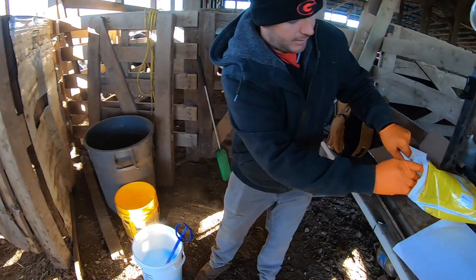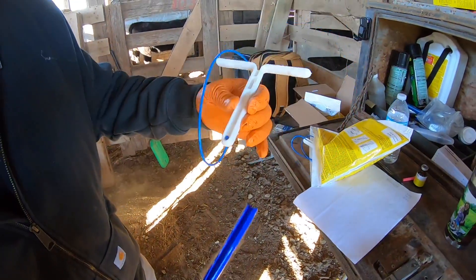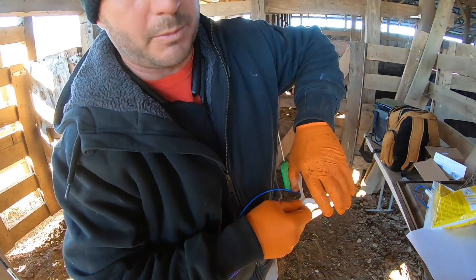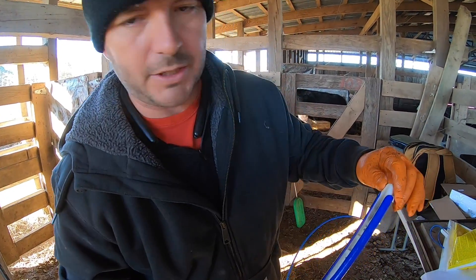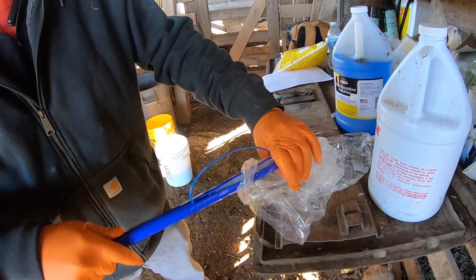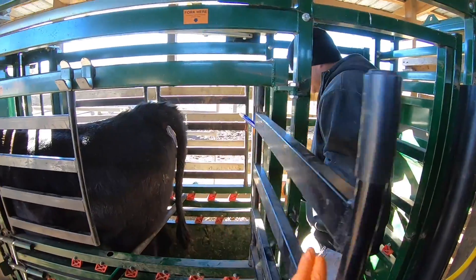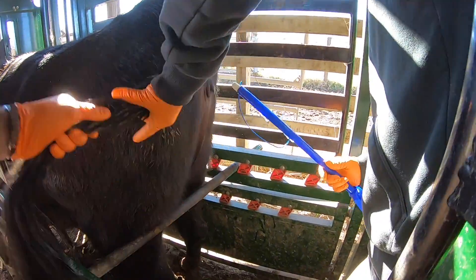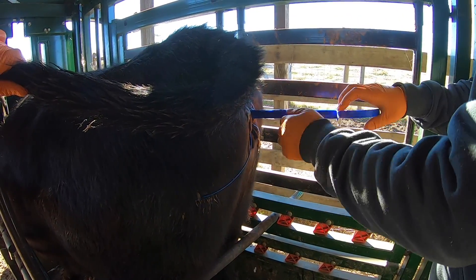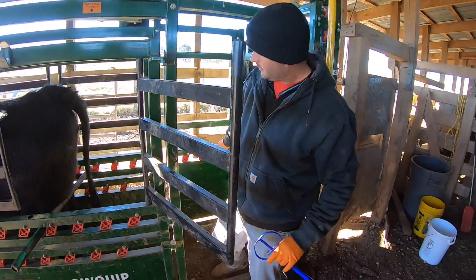We've got the CIDR here. Button down — you see that? Put the button toward the slit. First and foremost, always wear gloves — this is full of progesterone. Those little wings, they just fold in, and that's how you get it in there. Lube it up. Insert at a 45-degree angle up, then once it starts, level it off. Always hold the string with your thumb so it won't pull back. Pull the trigger, it releases. Easy enough.